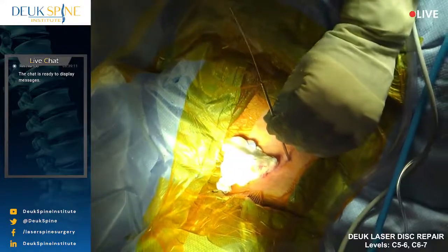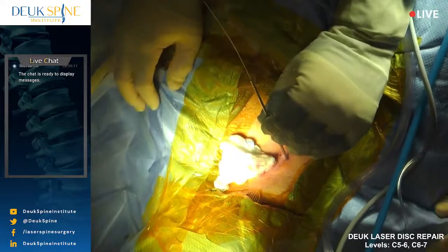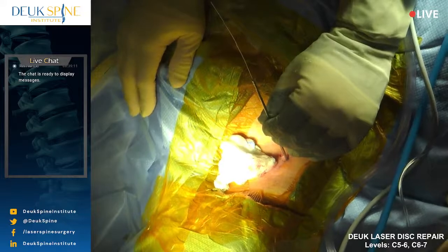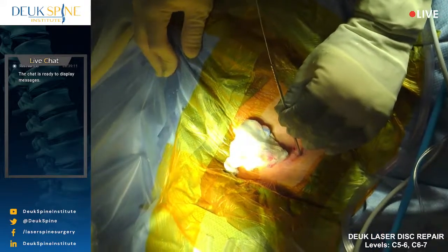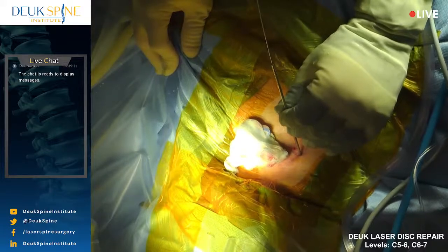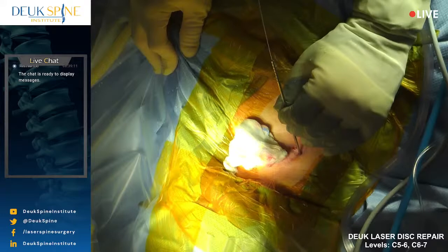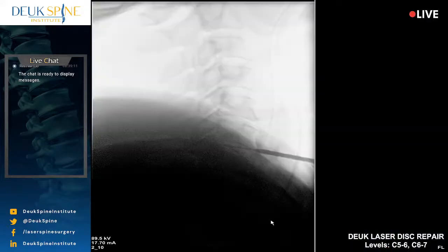Everybody in position. I'll need your help, doctor, for just a few more minutes while I get everything into final position to do the surgery. Perfect. That looks amazing. All right, so this thing is a little bit high in the disc at the front. Let's get an AP. Good. Relax. Let's get an AP.